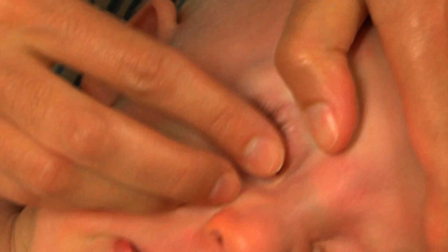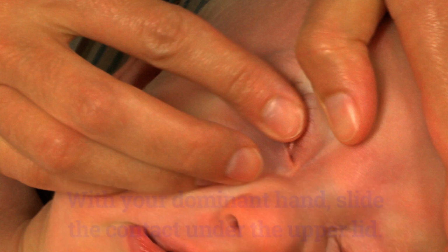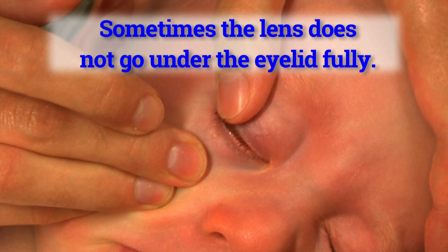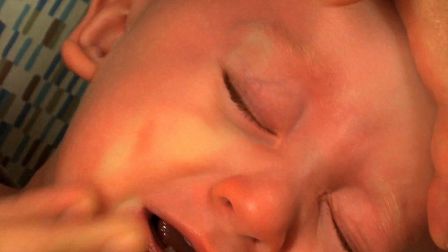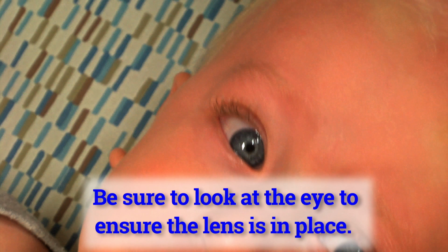With your dominant hand, you will slide the contact lens underneath the upper eyelid, parallel to the surface of the eye. Sometimes the lens does not go underneath the top lid fully. Be sure to pull on the lower lid to allow the contact lens to drop into place. Once you have safely inserted the lens, be sure to look at your child's eye to ensure the lens is truly in place.